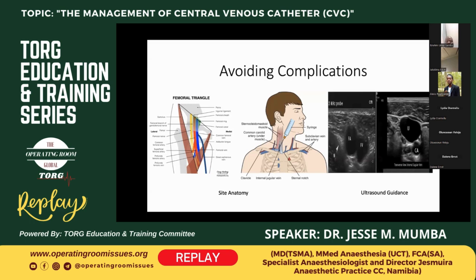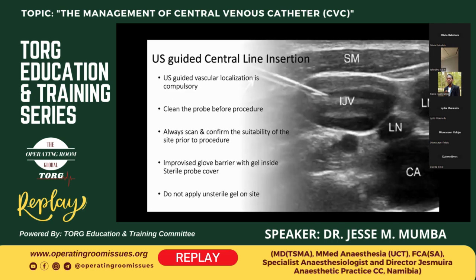So we need to advocate for educating the people that are going to place central lines, both in anatomy of the regions they want to access, and also in the use of other visual aids such as ultrasound guidance. So I just wanted to mention that currently the recommendations are that use of ultrasound is actually compulsory. And this goes without saying.